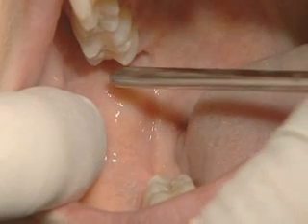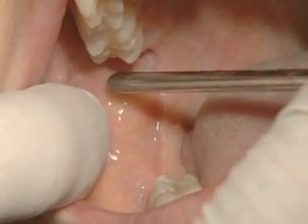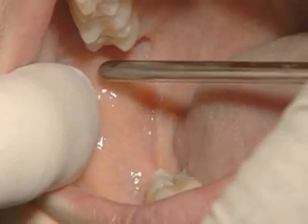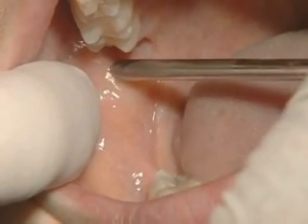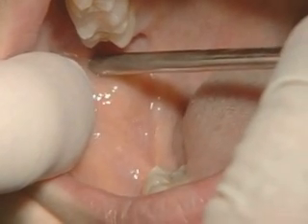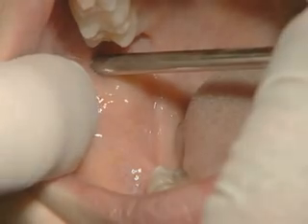So the needle will be coming at the height of the maxillary occlusal plane. And the lateral landmark is determined by the tendon of temporalis. Again, you do not want to insert into the temporalis, so you insert the needle just medial to that landmark. And this would represent the correct insertion point for the Gow-Gates injection.